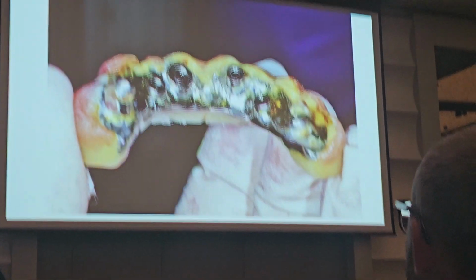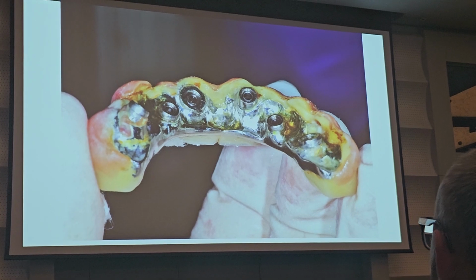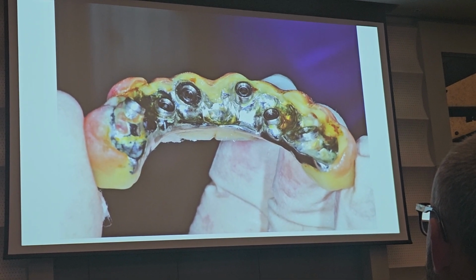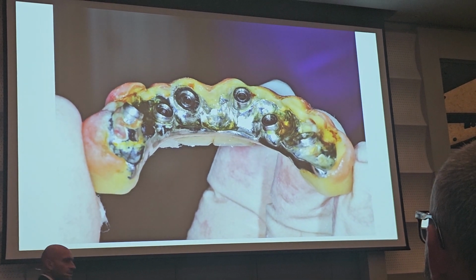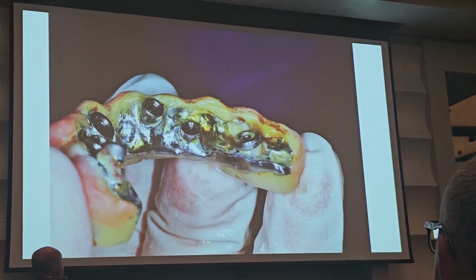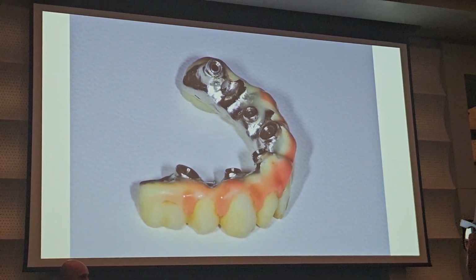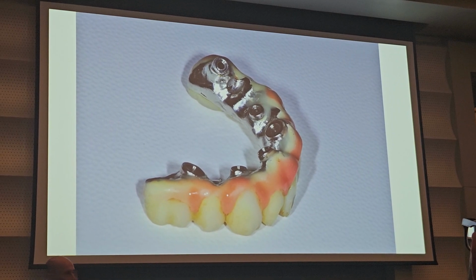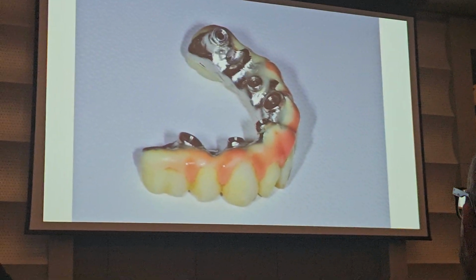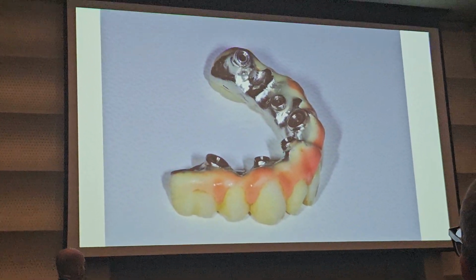So you see a lot of, even at the Congress, you see many speakers presenting this kind of design. Believe me, it's a mess. Anyway, the implants are not lost. You do not think that better hygiene has any influence on the implants. See. Anyway, I pruned all the prosthesis. I spent 2 hours in the lab. This chromic cobalt, you know, it's very strong. But anyway, now I have the correct design. What I should have done from the first day.